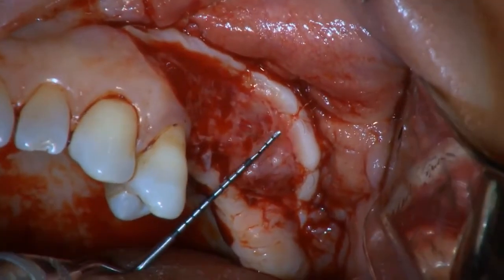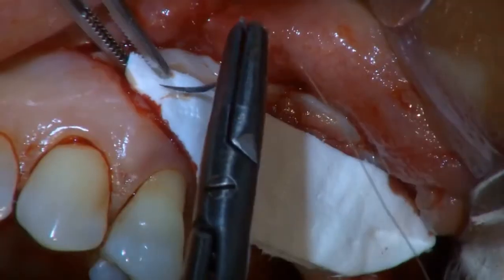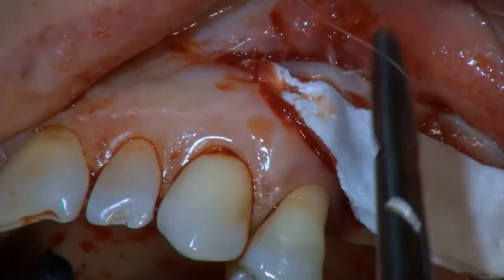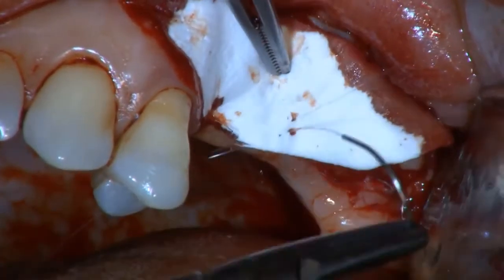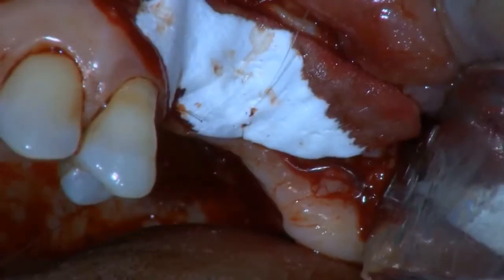Now, a Geistlich Mucograft, trimmed to fit the defect, is sutured onto the periosteal bed, adjacent to the strip gingival autograft with 6.0 sutures. This direct contact is important to allow transfer of keratinized cell signals from the autograft into the collagen matrix.